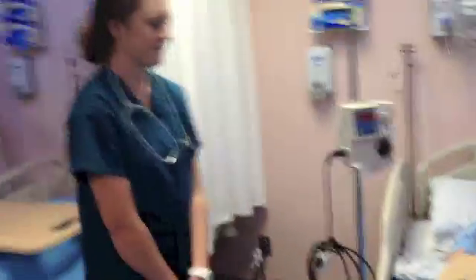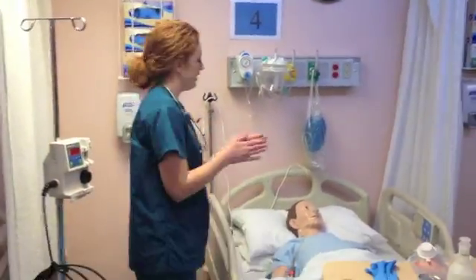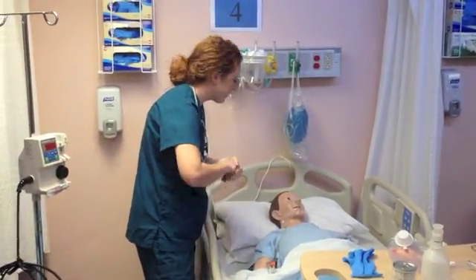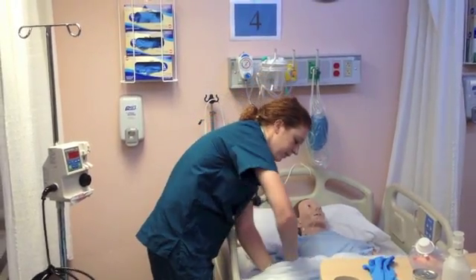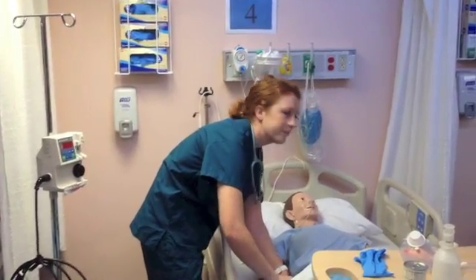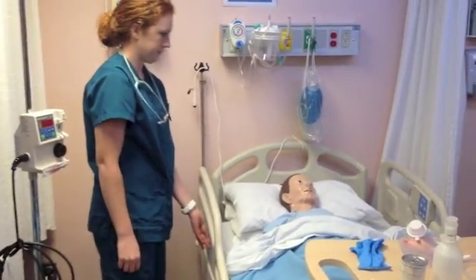Now Kelly here is going to begin by entering the room and performing hand hygiene like a good nurse. Hello, Mr. Smith. My name is Kelly. I'll be performing your enteral feeding today for your nasogastric tube. Can I check your wristband for your name and birth? Can you state your name? John Smith. And your date of birth? December 25th, 1929.